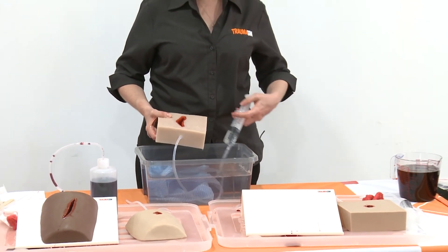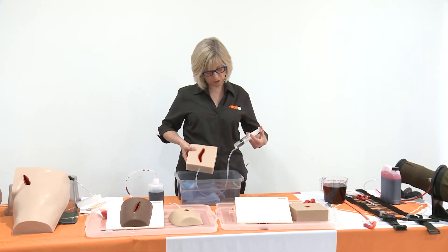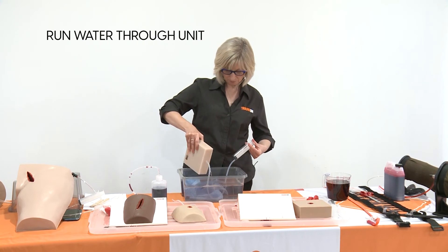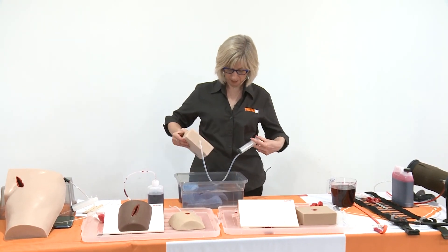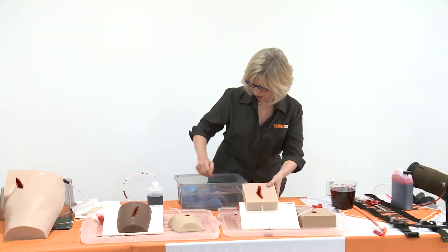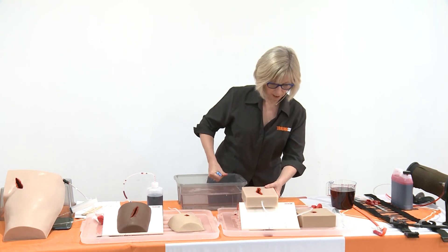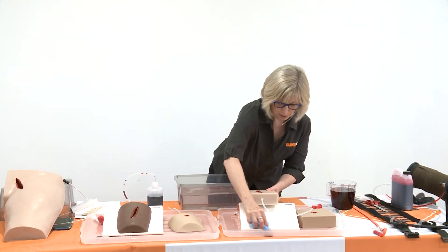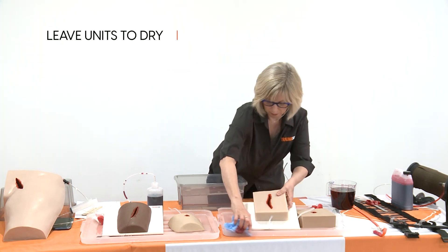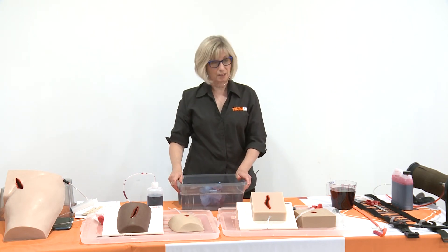If it starts to get thick, a bit of warm water will get it out, but just running a little bit of water through it is really all you need to do. I tend to keep the syringes because they're not being used for anything clinical — there's no reason you can't just wash them out and use them again and again. And that's really all you've got to do with it — it's very, very easy.